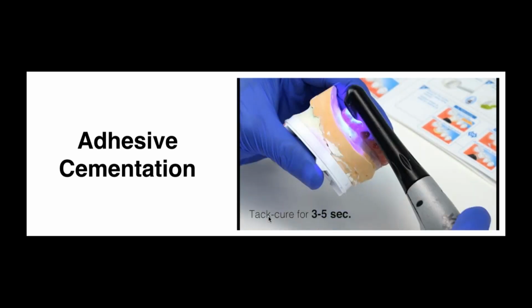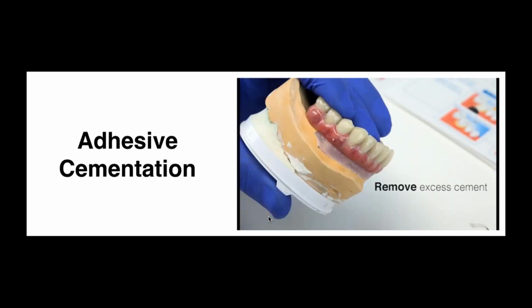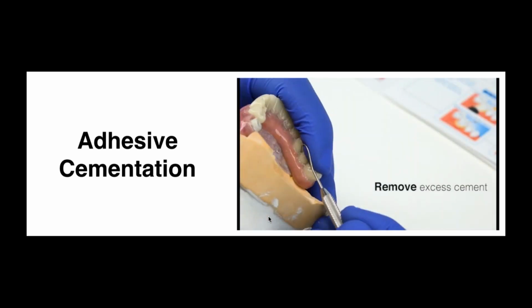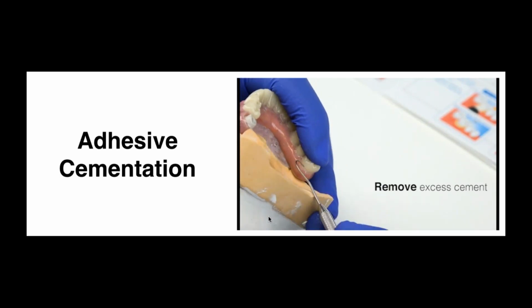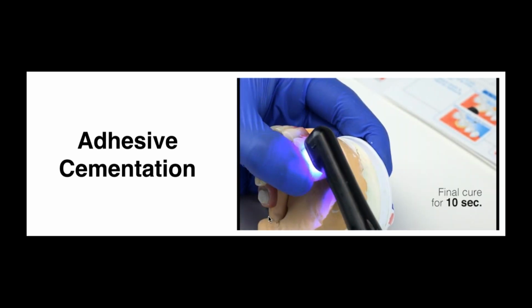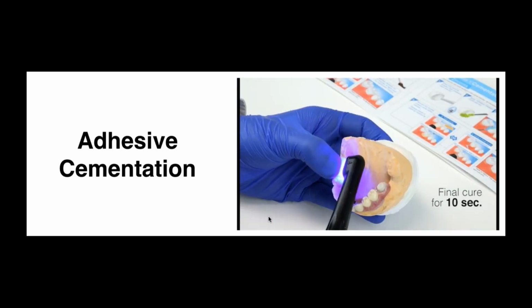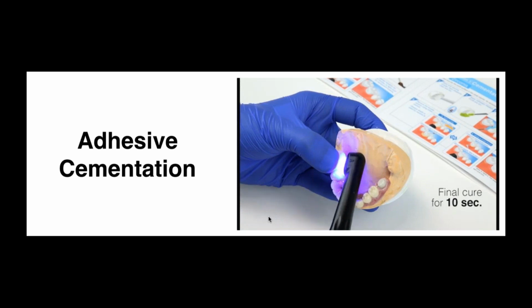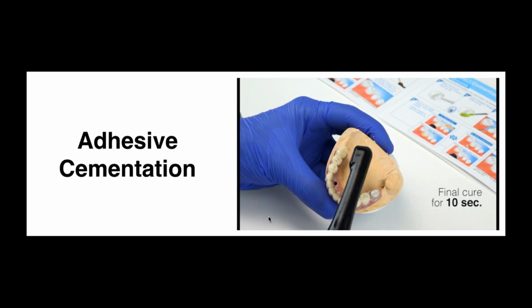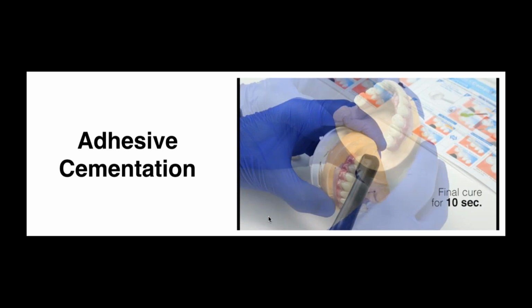Okay, so you can see here how easy and how clean it is to cement this extraorally. You can tack here if you want, or just use microbrushes. That's what I use mostly. Just the microbrush and remove the excess of cement, and then you can fully cure. Always when you're cementing extraorally multiple restorations, I like to place all of them so there's no excess of cement going on the margin of the neighbor crown, and then I cannot seat it completely. So this is very helpful to be able to cement this extraorally.